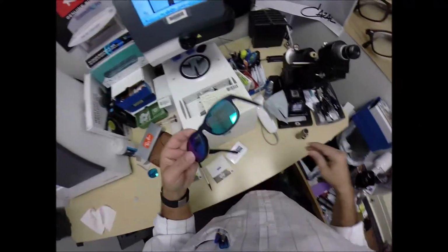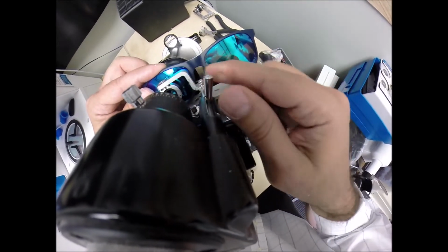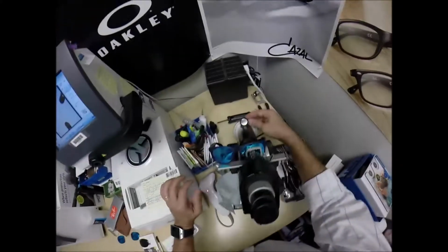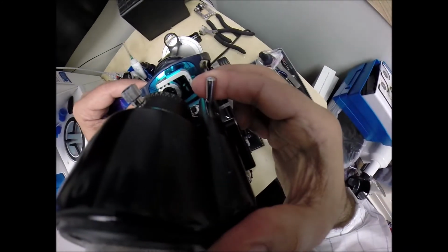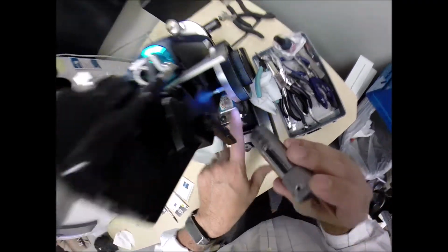Actually, my pupillary dots are gone, so let me put that back on there so I can measure everything perfectly as it should appear. Okay, there's a dot. Now we're going to turn that fine tune knob to 180. Read the power. I'm getting minus 2.50, exactly halfway between 2 and 3. Check the second curve of your astigmatism correction, and we end up at minus 3.25, one tick mark past 3.